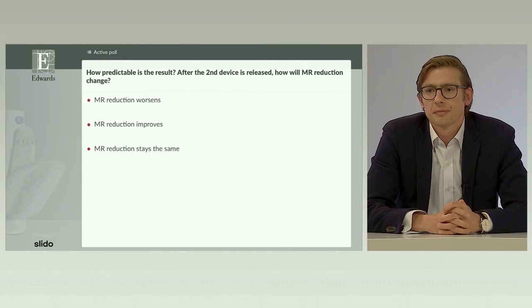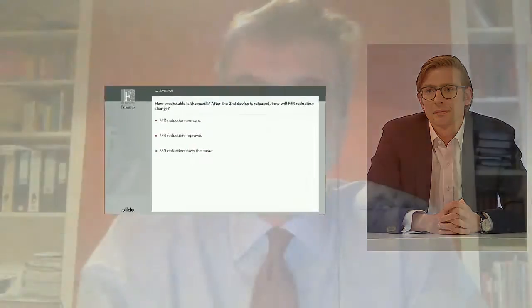So thank you, Philippe. It's a very elegant demonstration of the technique and also your very precise manipulation of the device and the finesse that you've demonstrated in delivering it and tensioning it and working very closely with your imaging colleague is very clear to see. While we wait for the response of this question, and we'll have to wrap up quickly after that, could you just tell us what's the median number of clasps that you're using? Is it usually a 1 clasp procedure, or is it usually a 2, or is even 3 possible in a patient with a very big annulus?